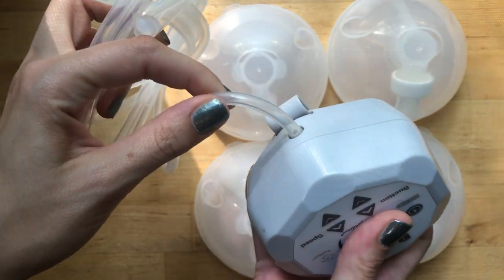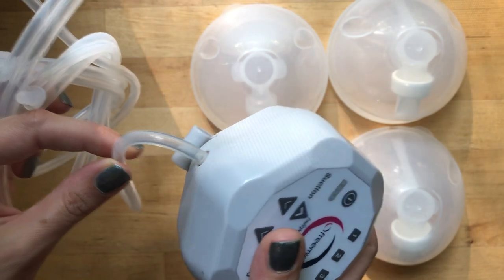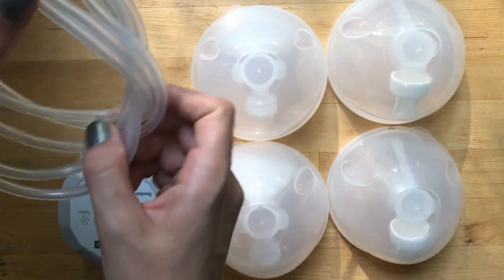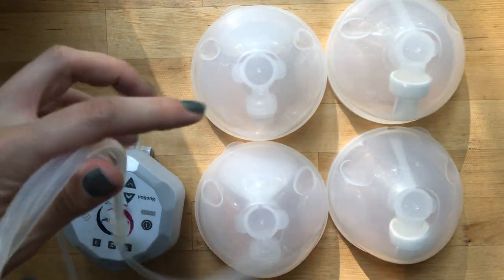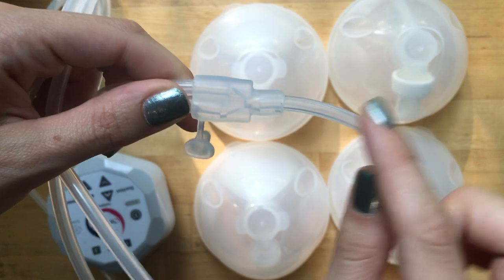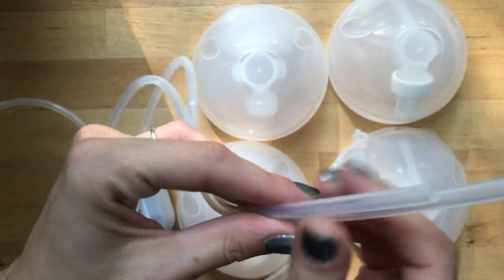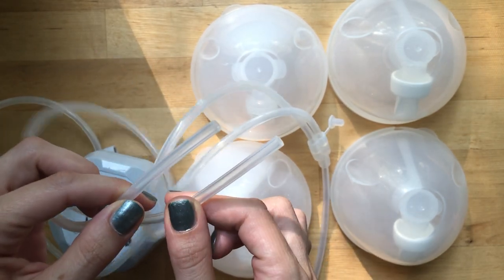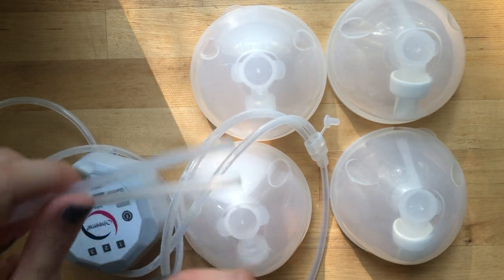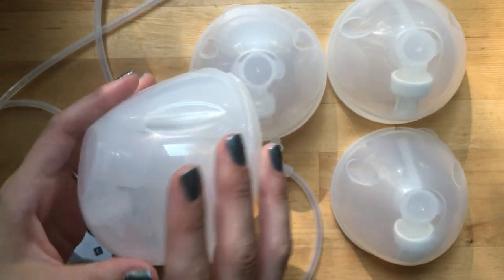There's one tube that comes out of the pump, which is handy because you can use just that one tube if you want to pump one side at a time - especially if you're feeding baby on the other side. For standard pumping I usually tie mine up in a knot so they're not swinging by my knees, because these are pretty long. There's a splitter that goes from the one tube out of the pump into the two tubes that go into the cups.